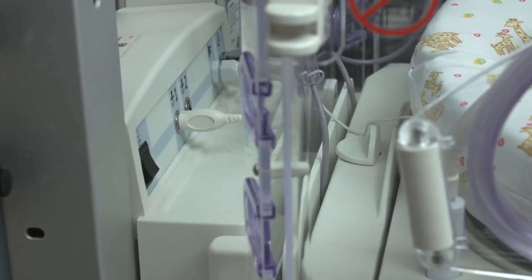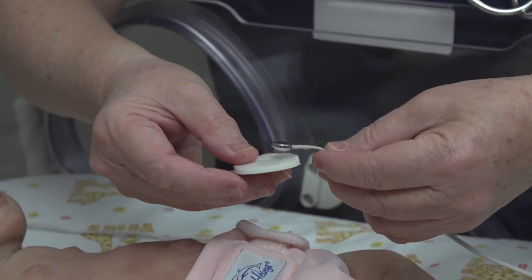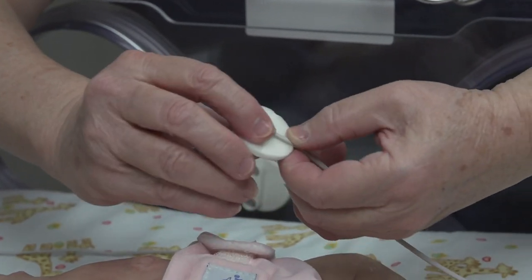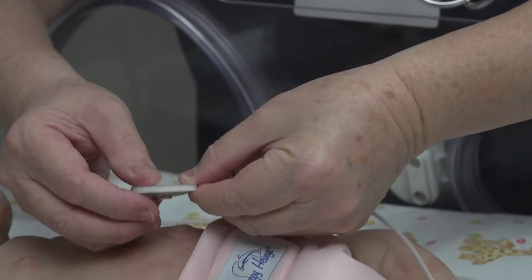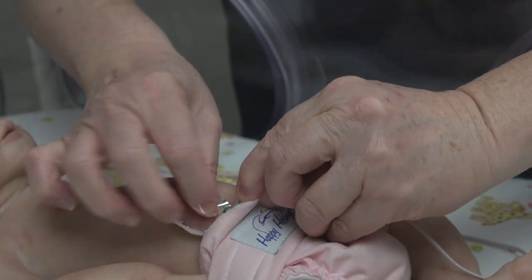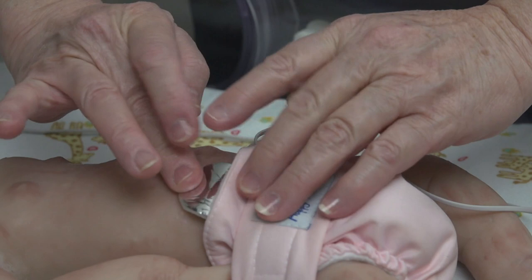Here are some tips for placing a temperature probe. Place the temperature probe securely on the reflective patch and then securely to the patient's skin, pressing and holding to ensure good contact. It can be placed on the back or abdomen depending on whether the patient is prone or supine.